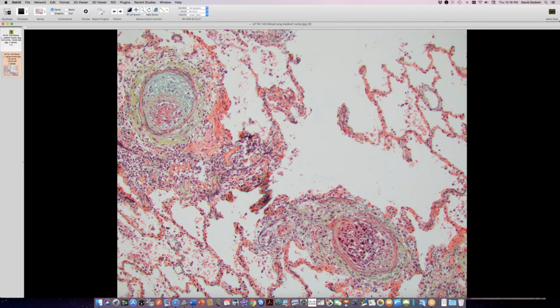This is very unusual, but I usually think about it, and I usually make that diagnosis once like a decade maybe, in a patient that has cancer, that has developed pulmonary hypertension, which is new or worsening. And if the CT on lung window shows a pattern of mosaic attenuation, even if there are no nodules in the lungs and no hint of a parenchymal abnormality.